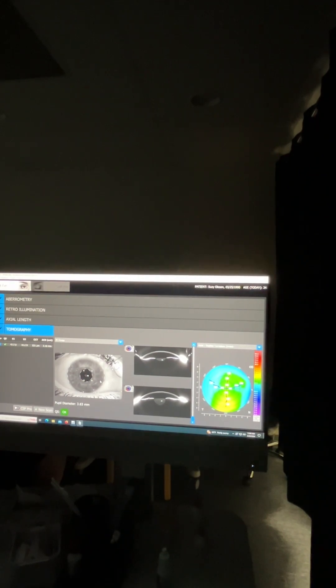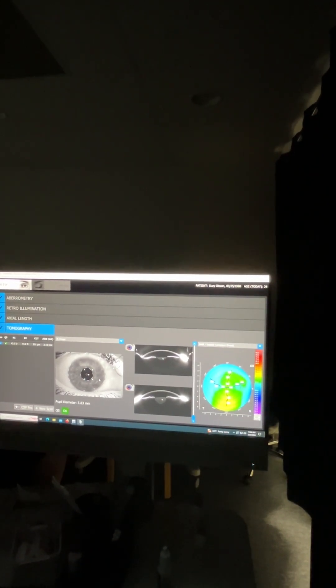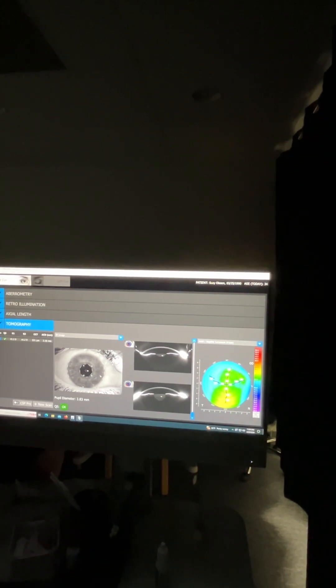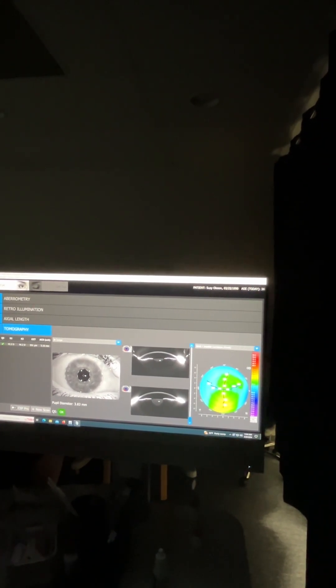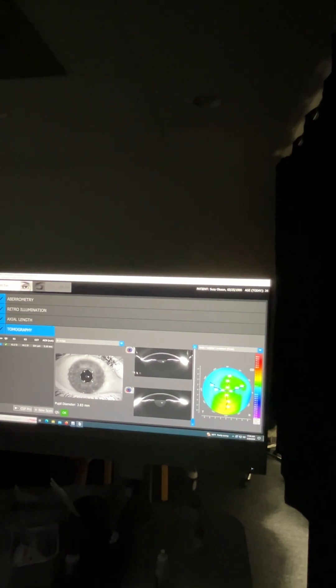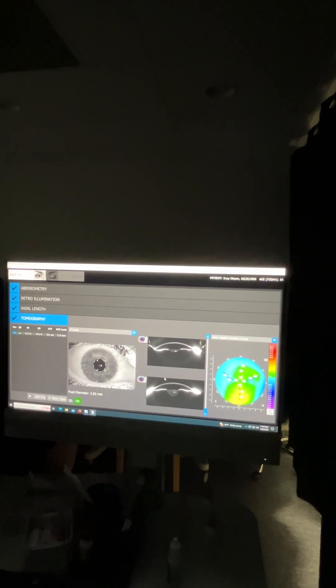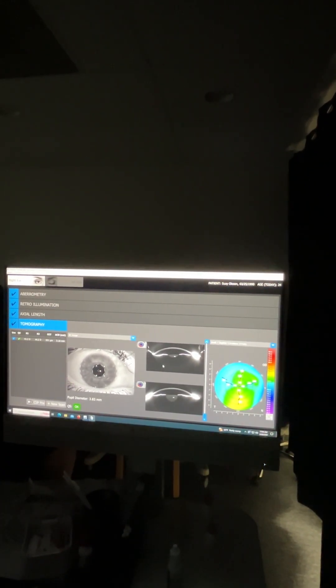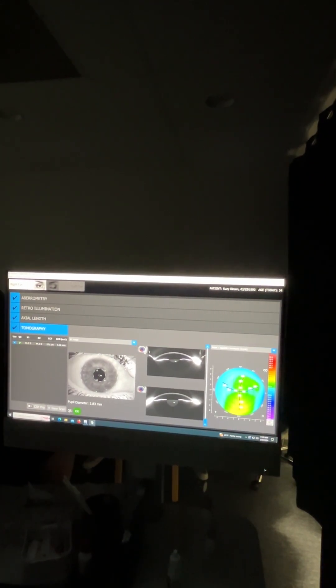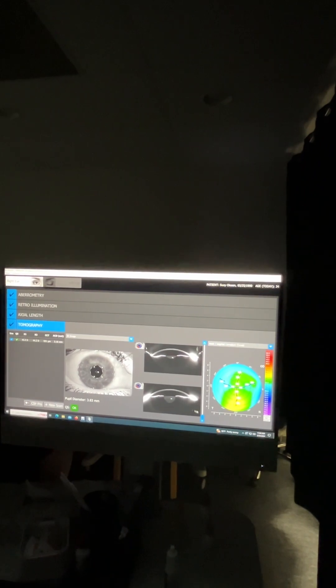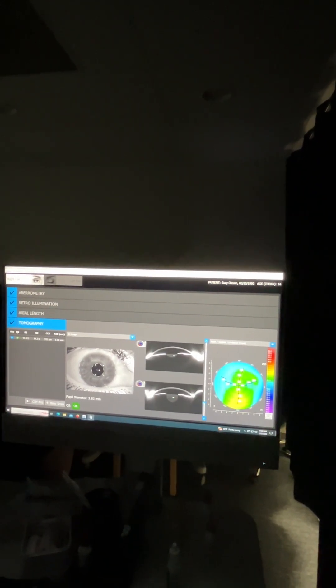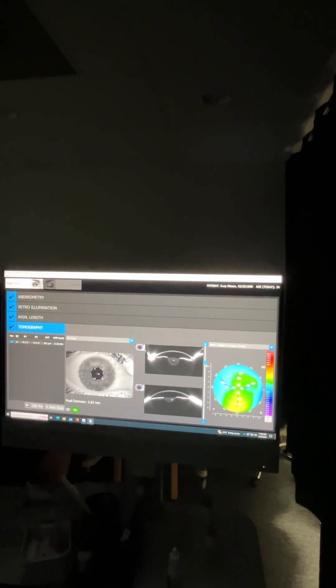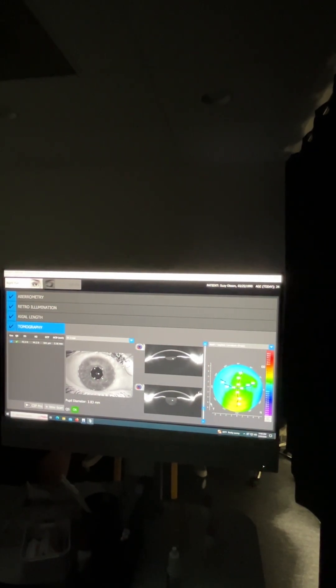As far as eyelid position, you can have them hold it open. You can help yourself. You can have the patient try to pull their eyelid for their part. You might be able to use a speculum or sometimes it requires just two people. But Susie, hers came out looking great. And then in the middle you have essentially two scans that are 90 degrees apart from each other. The blue bar represents the camera where the camera angle is, where the scan is. And so as you scroll around, you'll see your images will rotate and the top and bottom images are always just 90 degrees apart.